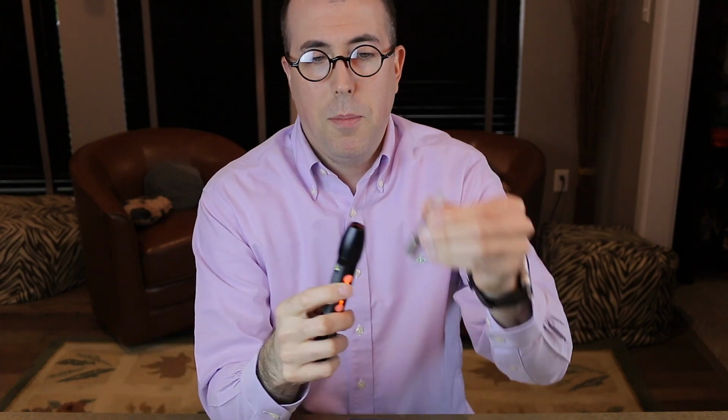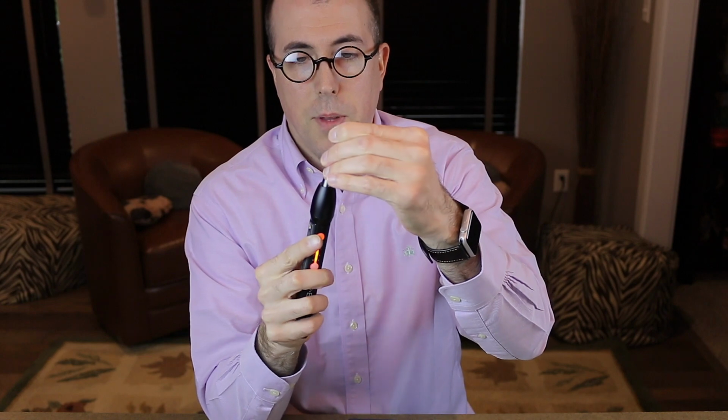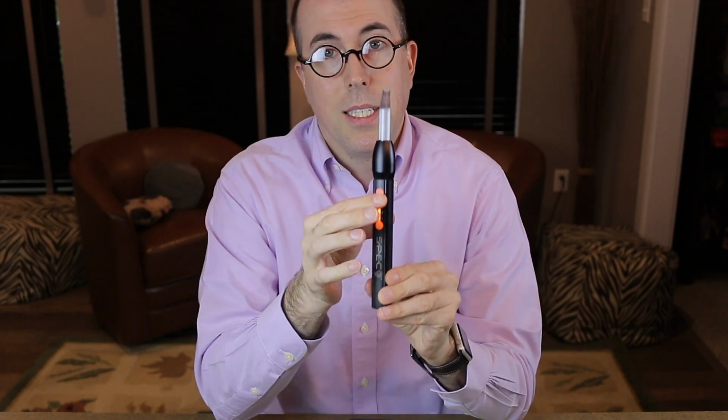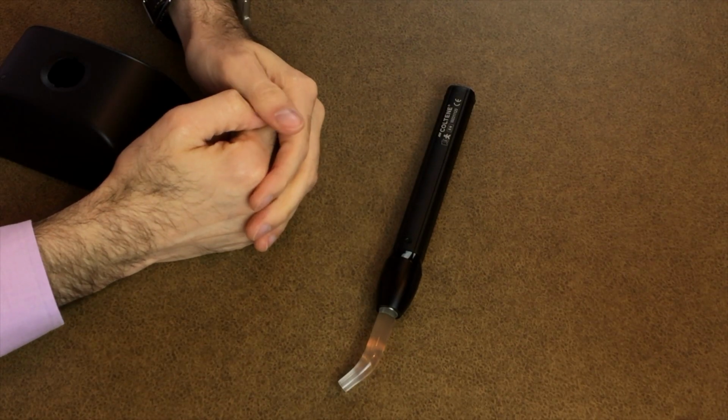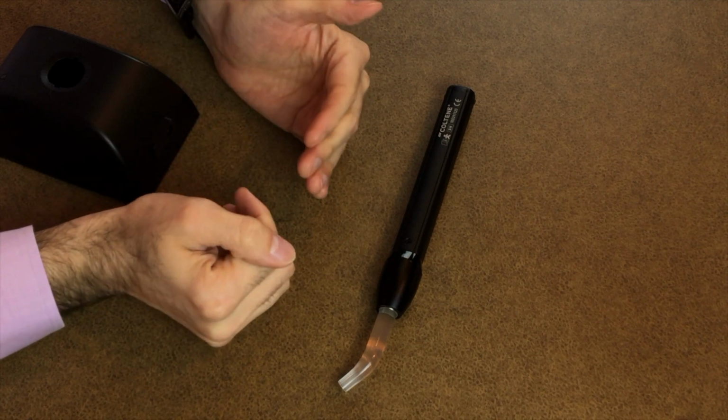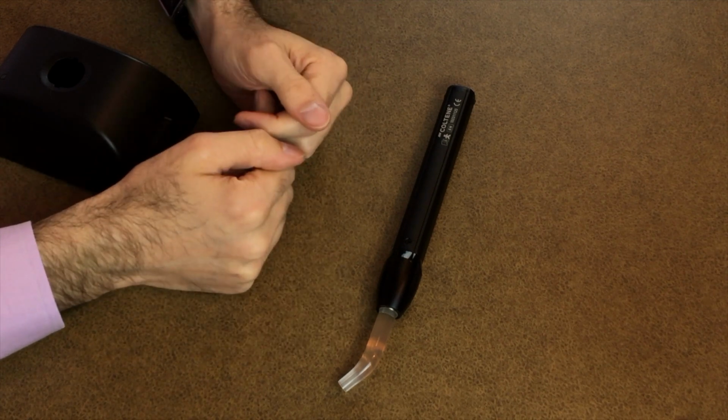So a word on disinfecting. Because the tip is interchangeable and can come out, there is a space where liquid can get down, and you just need to make sure that your disinfecting liquid doesn't get down in there, or else you'll damage it. Same with the buttons, they can't get any liquid around them. And so I'll usually just turn it upside down after we've wiped it down and just let it sit until the disinfectant has evaporated all the way, and then we're good to go.